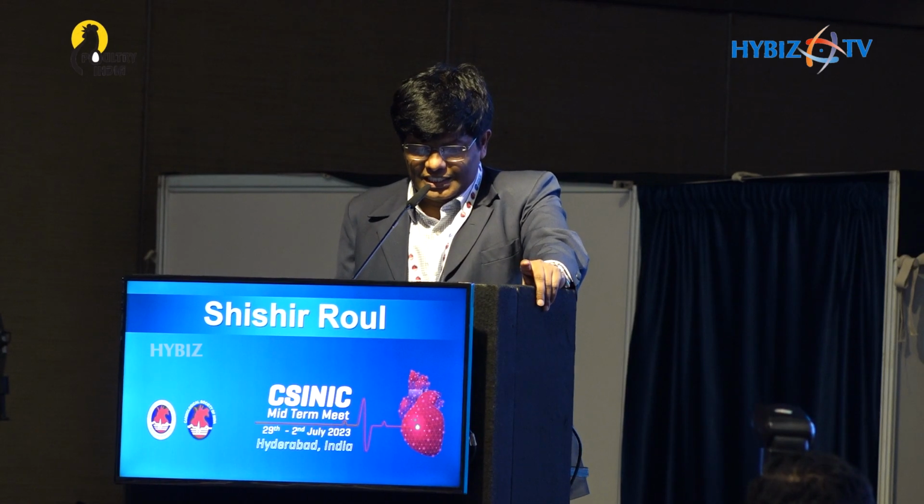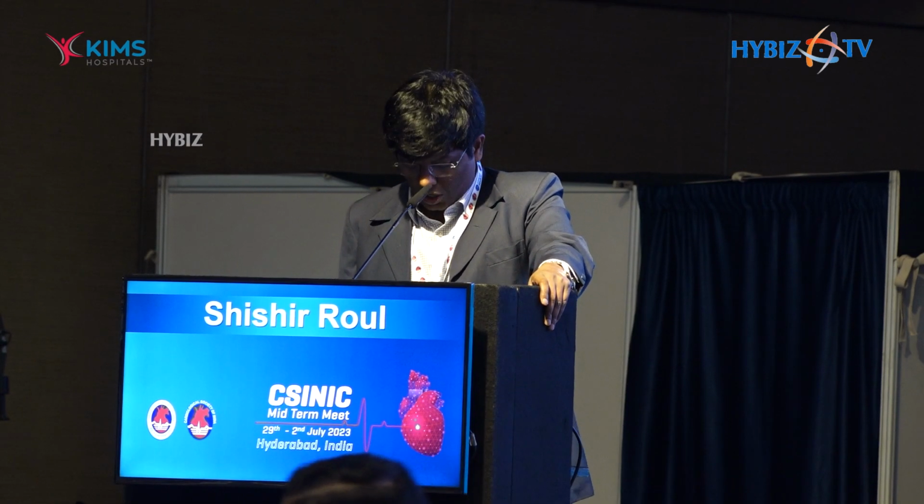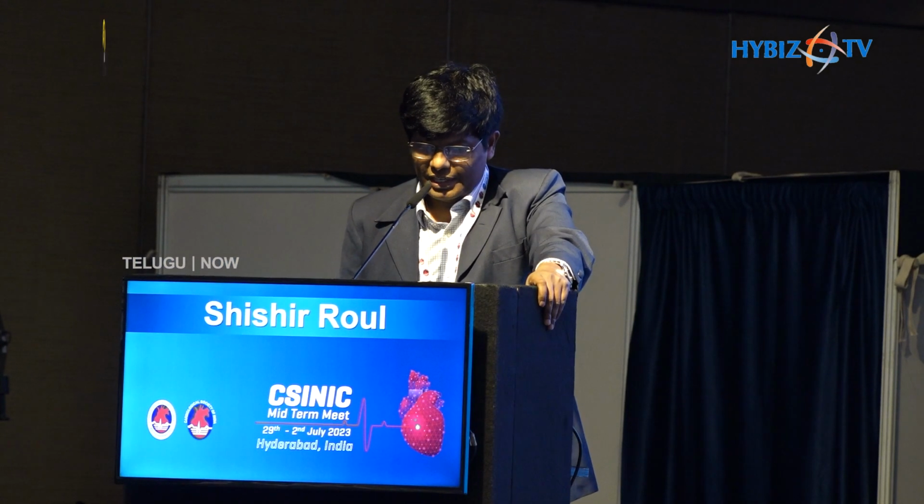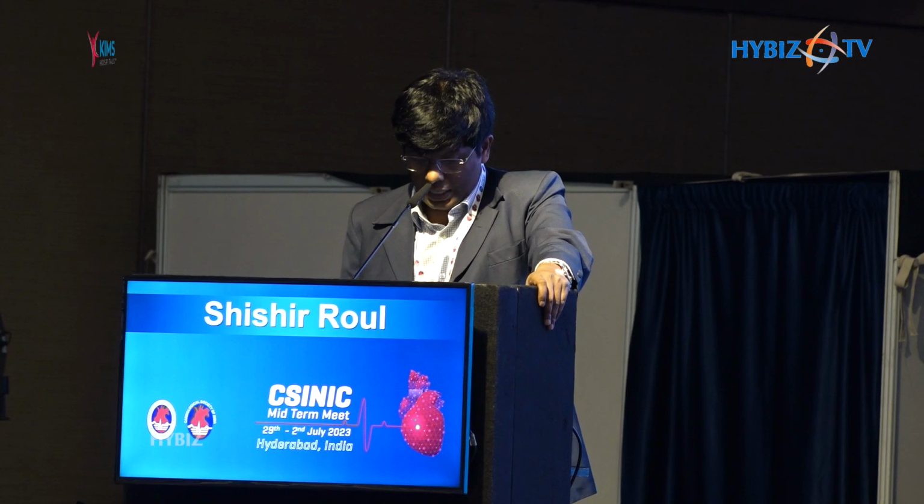At that point of time, my patient started having pain, because distally there is dissection and proximally there is occlusion. And what next? I was not able to take one more wire to cross the stent, and I could neither take the stent in nor take it out. In between, I saw there was crumbling of the stent, and my snare, what was normally available, also didn't work. So the second stent was now hanging in the aorta, there was no stent balloon inside, and there was only a little support from the wire.